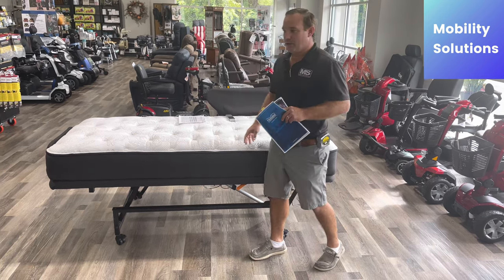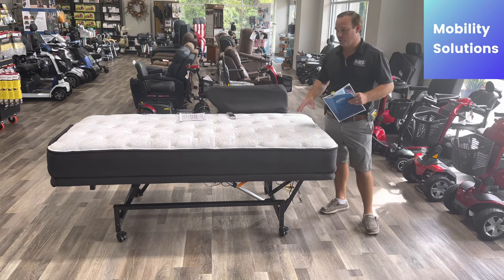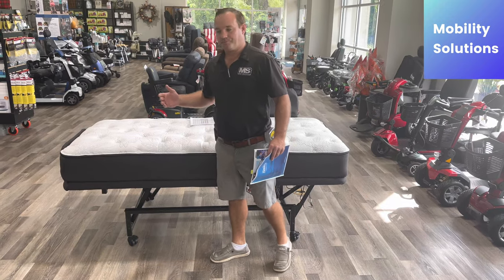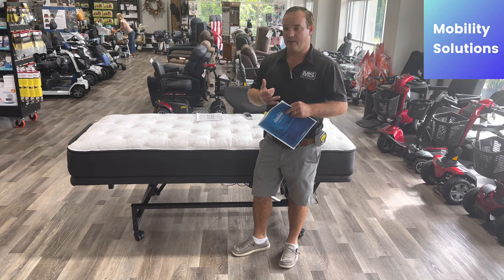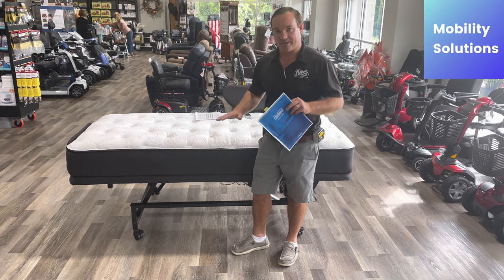But this is a Flexa bed. This does everything a hospital bed pretty much can do — the head comes up, the foot comes up. A problem we hear is someone already has an adjustable bed and they're looking for rails to go on the bed. It's hard to find, and the bed may be too low, too high, or needs to be adjusted later.